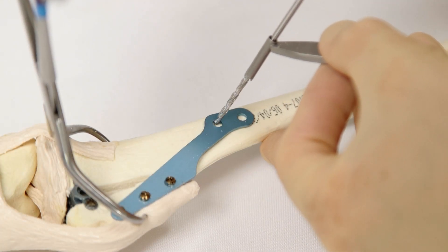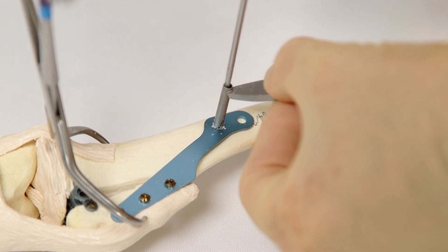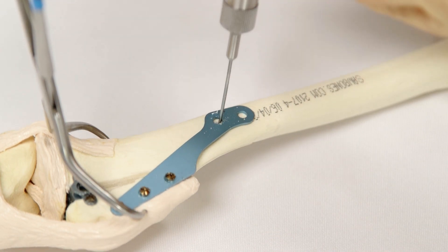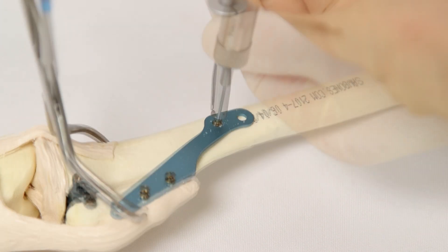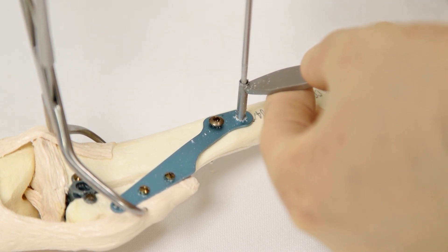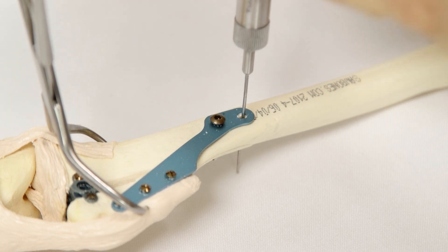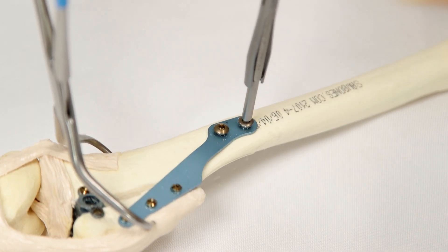Now drill the two distal plate holes in the tibial diaphysis using the appropriate drill bit for the size of screw intended. Either 2.7 mm or 3.5 mm screws may be used here. Be aware of the edge of the tibial cortex and direct the drill to maximise bone stock. Measure the depth and place the screws, ensuring good engagement of the plate hole with the screw head.